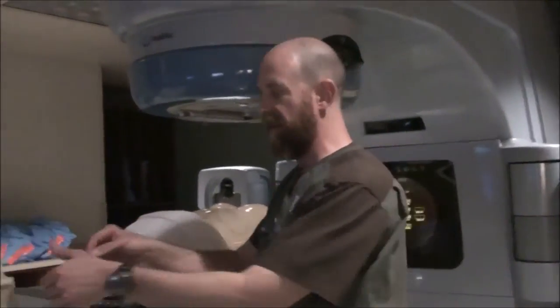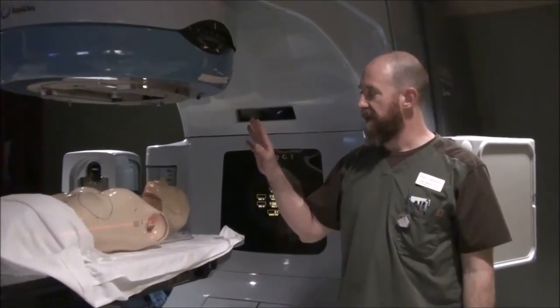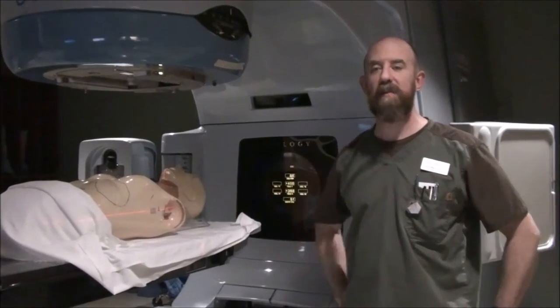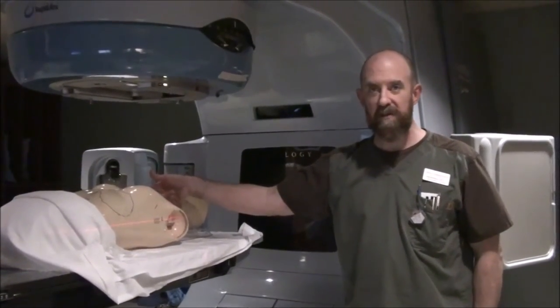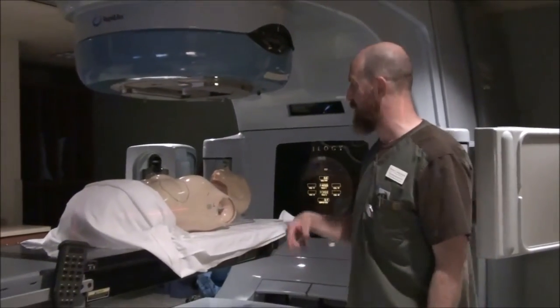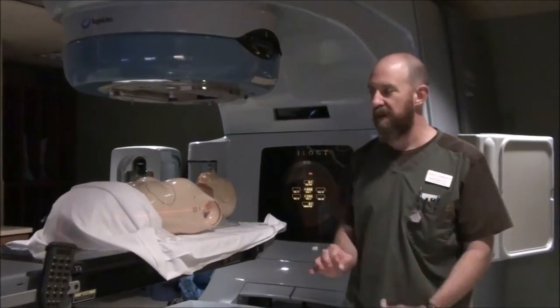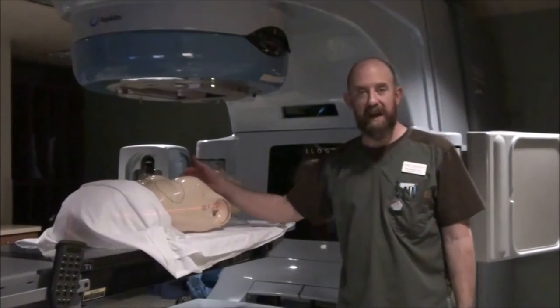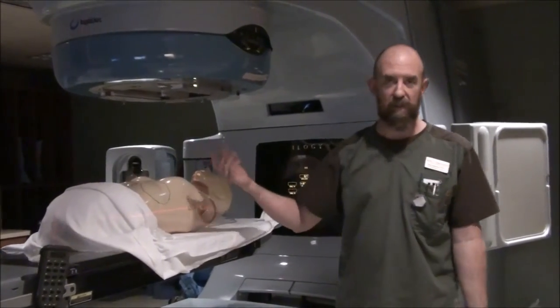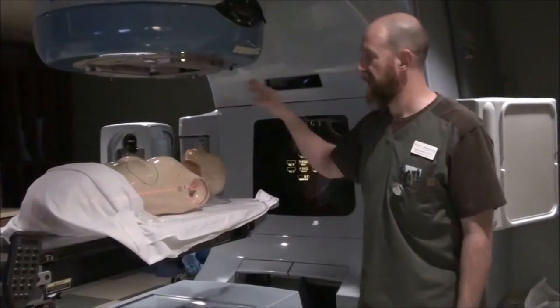Once you've got the person ballparked, mask on, chin up, akimbo, you've taken a separation where you think it should be and got a midplane — go fluoro. Once you've fluoroed, call the doctor. She'll come in, possibly say you were off by a centimeter, do some tweaking, and then you're good. If you move in and out very much, your separation could change, so you may need to recalculate your midplane SSD. Come back in and mark your CR.